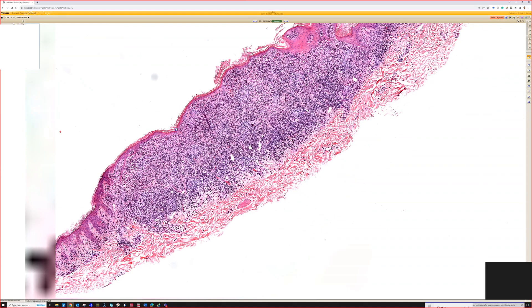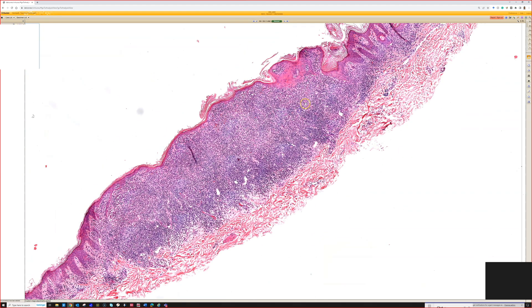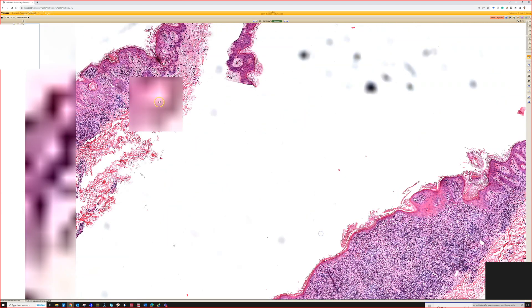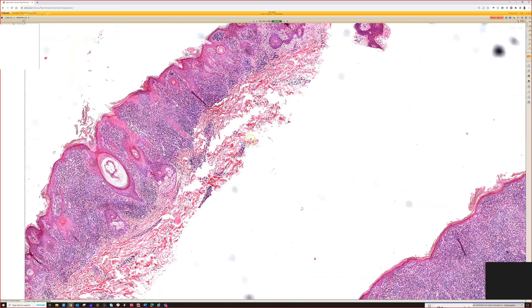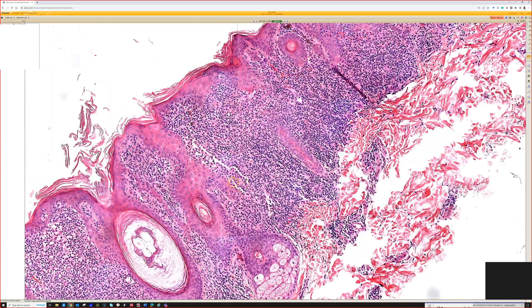My mentor Doug Parker pointed out that the inflammation is very dense and very even — evenly distributed, not patchy — and for some reason there's not much fibrosis with it. Even though nevi can regress, halo nevi don't seem to result in that dense, scar-like collagen regression. If we saw patchy inflammation and regression-like areas, that would make us stop and get more concerned.